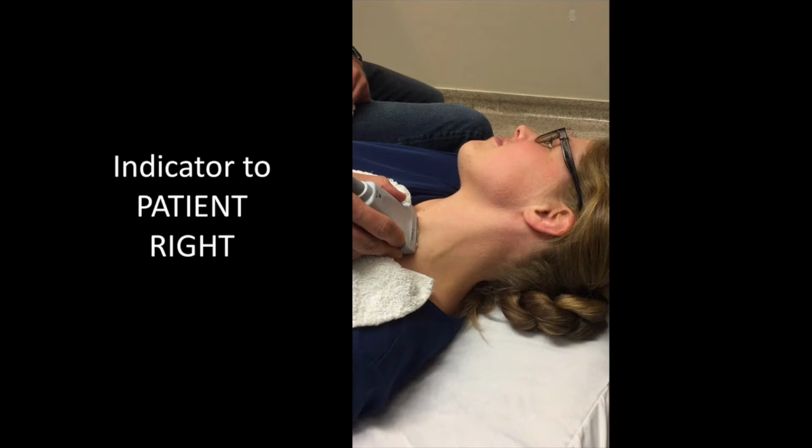Similarly, you may have to extend their neck a little bit to look at the carotid well, but overextension will really tighten those sternocleidomastoids and block you from getting a good view of the carotid. So a neutral position usually works well with respect to extension and flexion of the neck. And even though it's best to have the patient supine, you can usually get a pretty decent image even if they're at 45 degrees.